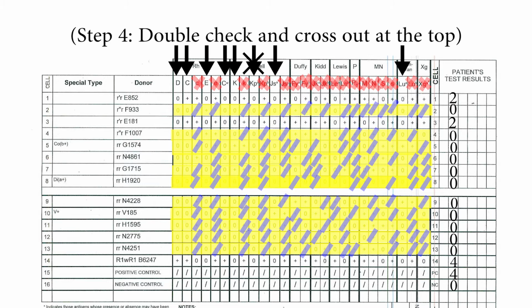Now that we have ruled out most of the antigens as possible causes, we are left with only D, big C, big E, Cw, big K, Jsa, and Lutheran a antigens. As I'm looking at the patterns, the possible antigens here are D and big C. However, we still have to prove our theory by ruling out all the other antigens by using selective cell methods.